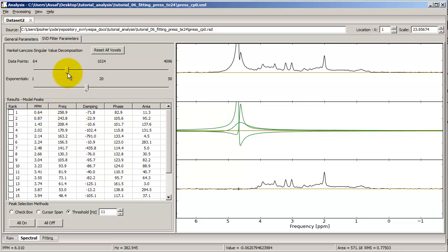Now, once the filter is run, it actually runs automatically once you start it, and you feed it the number of data points and exponentials, and we're going to go over in a moment what these actually do and what they mean, the filter spits out a set of peaks that it identifies. You see that there are 20 exponentials here, and our list of peaks has 20 entries. So this means that this SVD filter is trying to decompose our signal, our spectrum, into 20 Lorentzians. Now, our spectrum might have many more, but this is what the SVD thinks it should do. So it kind of tries to find the 20 most dominant Lorentzians in the spectrum and say, okay, here they are.